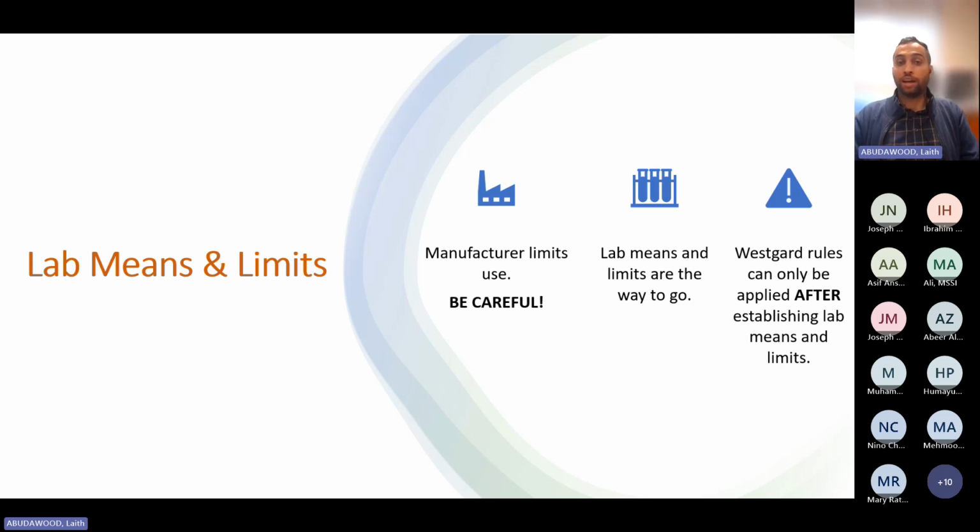However, as we said, remember when we established the QC ranges, we ran on a Satellite, we ran on an RMax, we ran on a Compact Max in our factory. So the Compact Max maybe is reading slightly less than the RMax, and slightly higher than the Satellite Max. So if the customer says, your target is 14 because it's exactly in the middle, maybe your Compact Max in the factory was always reading 13 seconds. So in this case, you'll always look like you are below the manufacturer target.